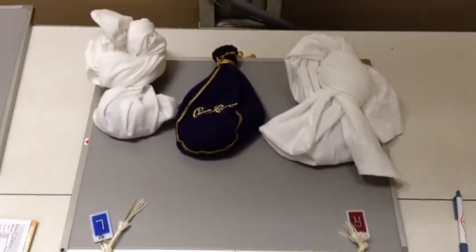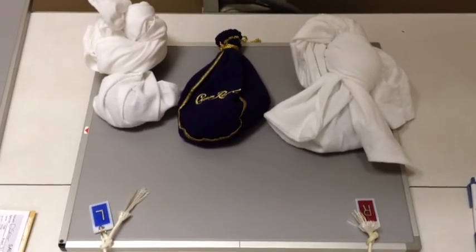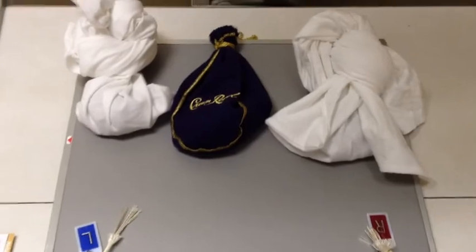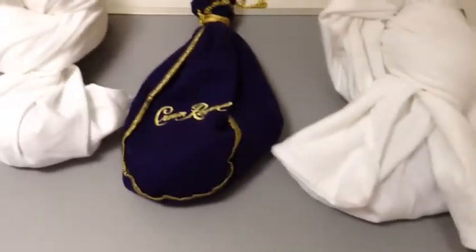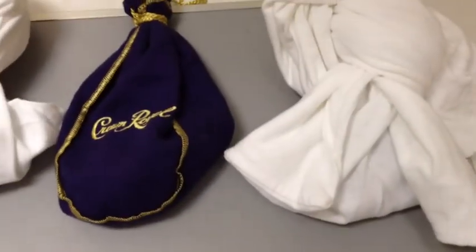Okay, for all you doctors and technicians wondering how you can irradiate more Southern Flying Squirrels in one shot, this is your answer. It's easy. It's one, two, three — aptly named Oscar and Bandit.